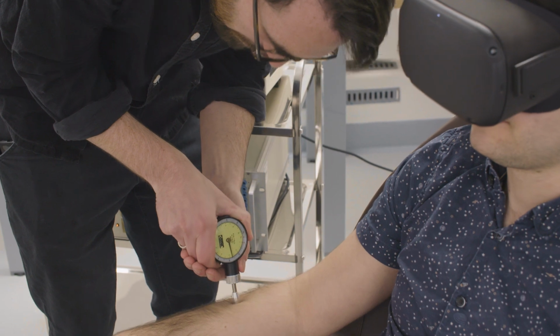One of the things that we're particularly interested in here as well is understanding how pain changes during chronic pain states. One way that we do that is by using electrocutaneous stimulation to sensitize the skin. So if I just take this virtual reality headset off you, I'll now show you exactly how we do this.